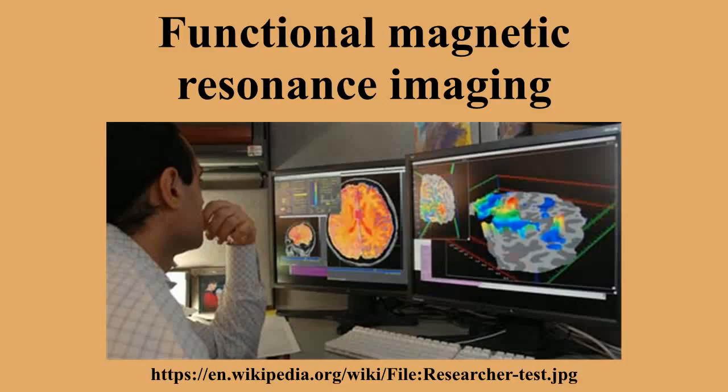If the neurons keep firing, say from a continuous stimulus, the peak spreads to a flat plateau while the neurons stay active. After activity stops, the BOLD signal falls below the original level, the baseline, a phenomenon called the undershoot. Over time the signal recovers to the baseline.